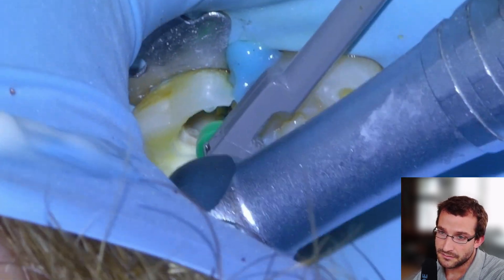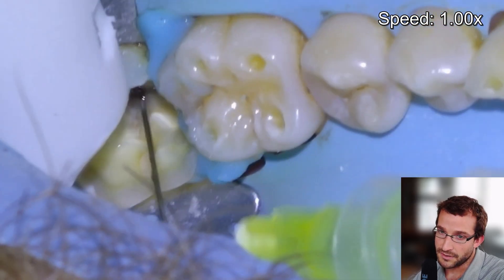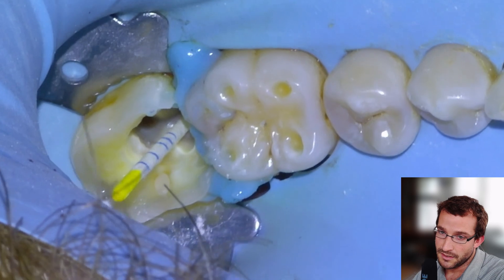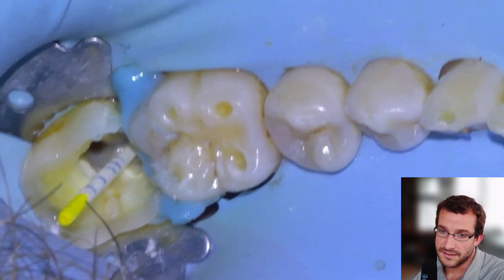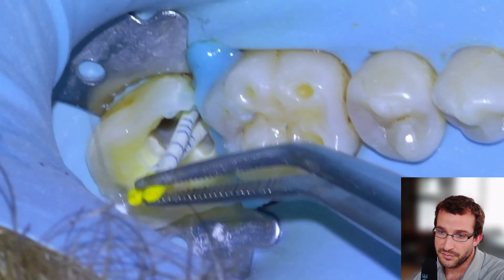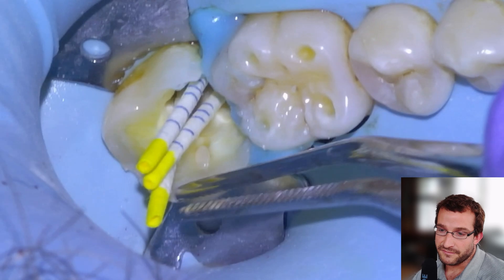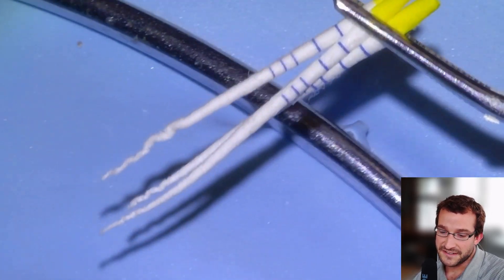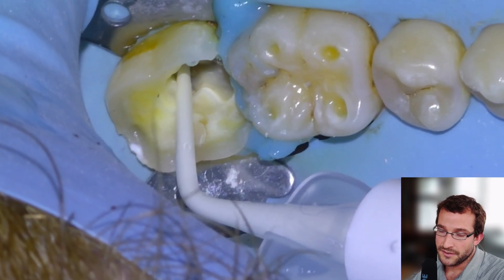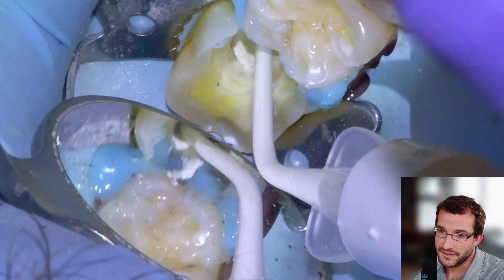35/06 here — final file — using the apex locator clipped to it for our length. Then we're going to irrigate, use an endo activator, and there's our final preparation. We're going to dry with paper points — these are F1s, which I think is size 20/04 taper, maybe 06 taper. Then fill up the canals with a flowable bioceramic sealer.